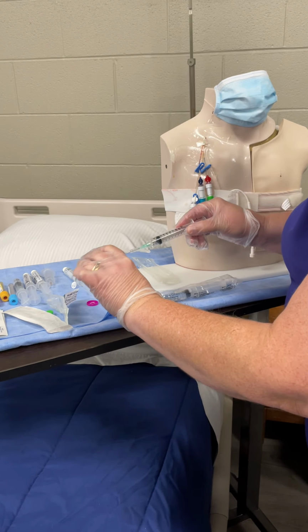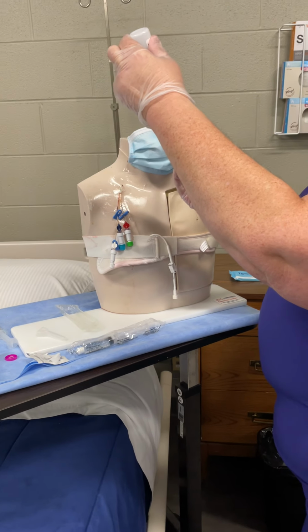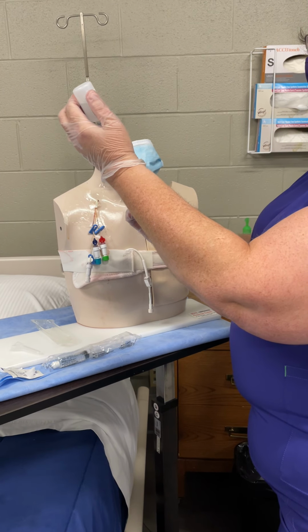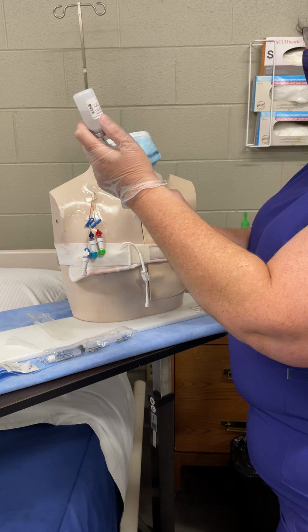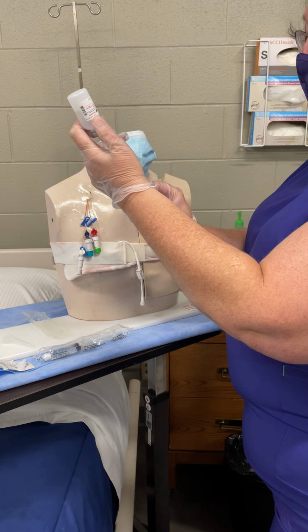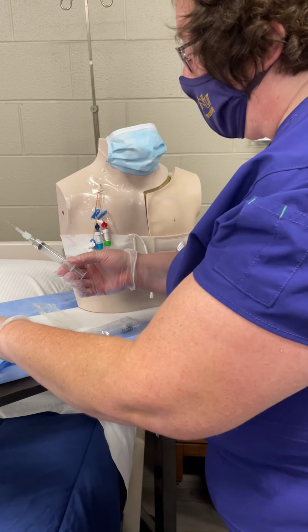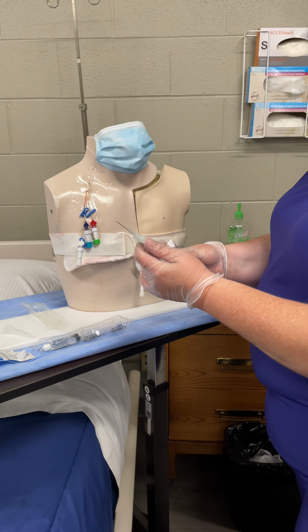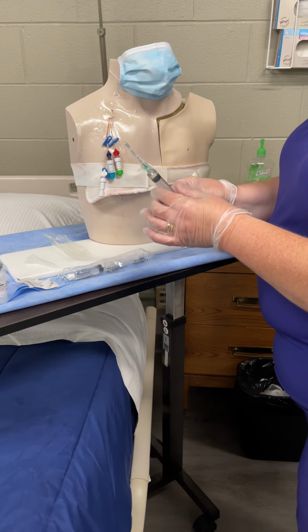Inject that air into your vial. Push it in. Bring it back. And if you guys have given meds like this, you know you've got to be careful so your syringe doesn't go flying across the room when you're tapping it, right? All right. Because we're going to give this through a line, we can go ahead and cap that. Okay, so we got this.